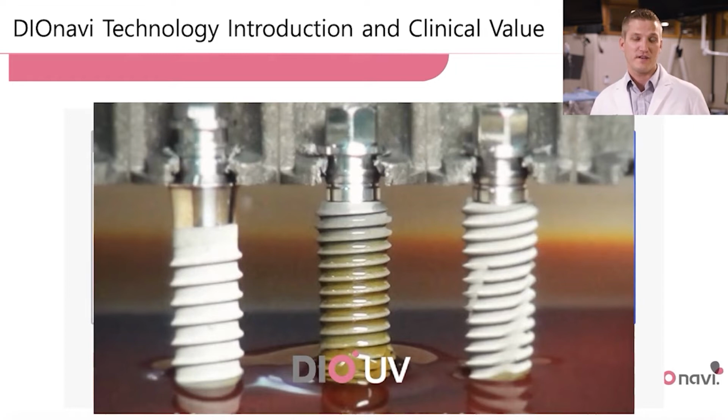Really, really impressive. That UV implant I'm seeing routinely placed, and 4 to 6 weeks later, ISQ readings well above 70. That's really, really exciting to offer that to our patients. They no longer have to wait as long as they've been used to, and then we can get to the restorative procedures even sooner. It's a win-win for everyone.